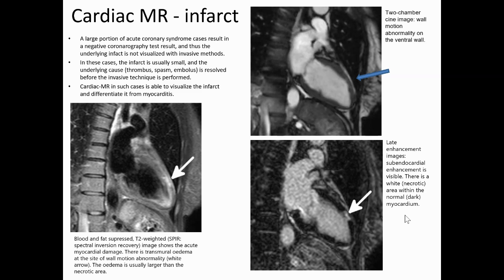Now, areas that are dead, that are infarcted, will not be able to enhance the contrast material because they don't have a blood supply anymore. But through diffusion, they will be able to take up some of the contrast material, and because they don't have any proper veins since they're dead, that contrast material will remain within that area.